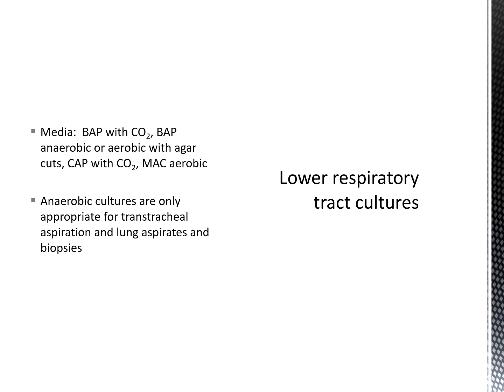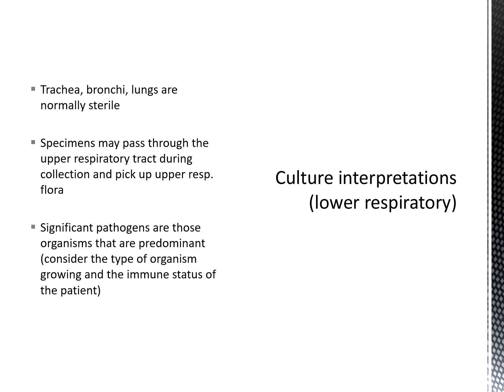Now remember, anaerobic cultures can only be done on transtracheal aspirations, lung aspirates, and biopsies. A lot of times those are actually classified as wound cultures because of that reason. Some other lower respiratory tract samples would be transtracheal aspirates, bronchial alveolar lavages, lung aspirates, and lung biopsies. Just keep in mind the trachea, the bronchi, the lungs are normally sterile. You have to remember, though, that when these specimens are collected, they do pass through the upper respiratory tract, and that causes it to pick up normal respiratory flora.